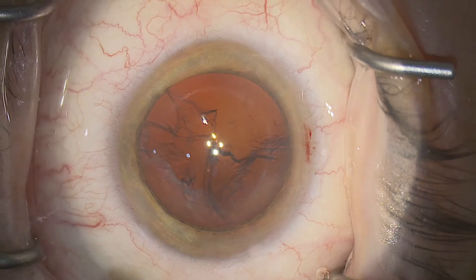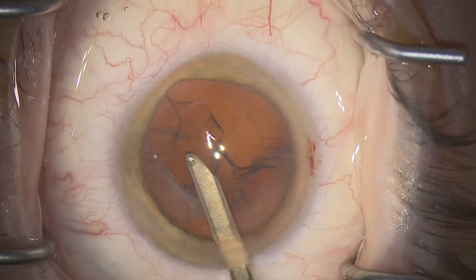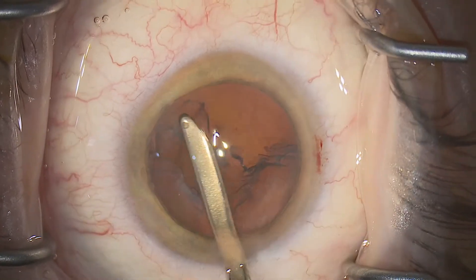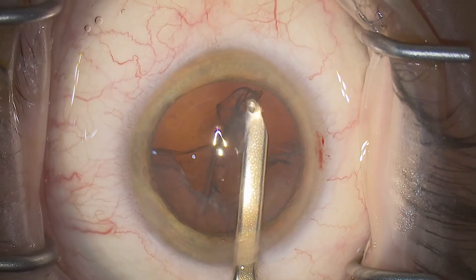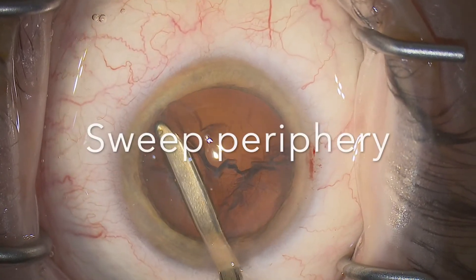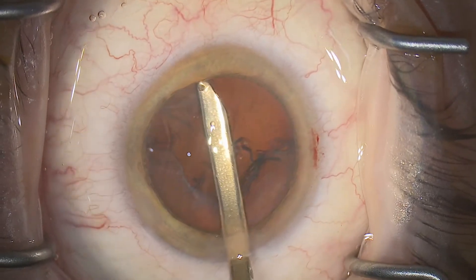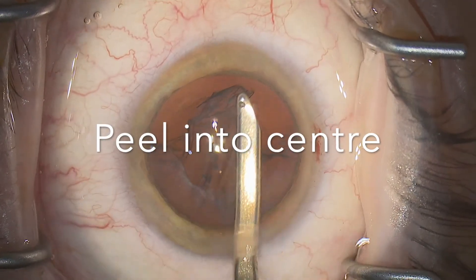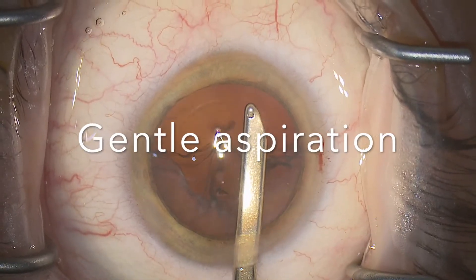Okay, back to INA technique. The cataract has been removed and we're ready to clean up the cortex. I'd recommend starting through the main entry site — we're sweeping the periphery, engaging and stripping into the center, and then aspirating. Let's see that again: we're sweeping under the anterior capsule there with a tangential movement in the periphery, stripping into the center, and then aspirating in the rexis plane.